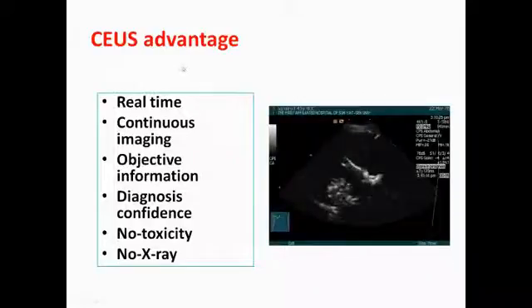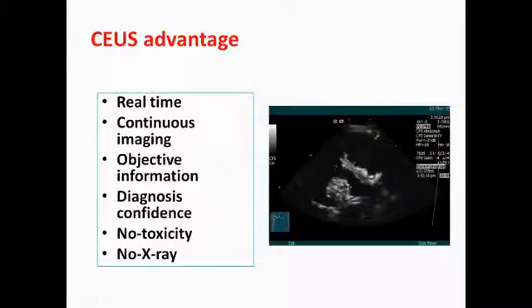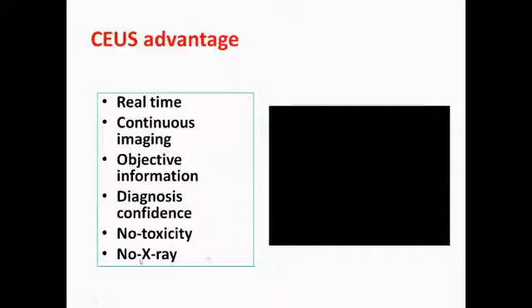So the advantages of CEUS include its real-time, continuous imaging, objective information, and the diagnostic confidence it brings to doctors, with no toxicity and no X-ray.